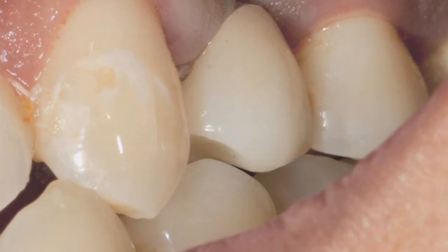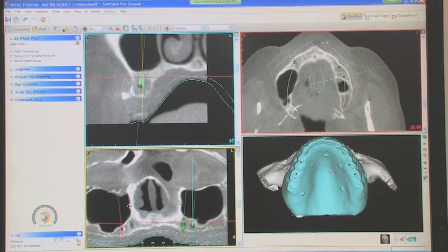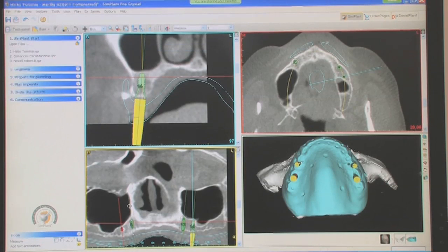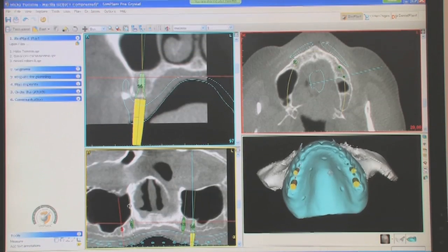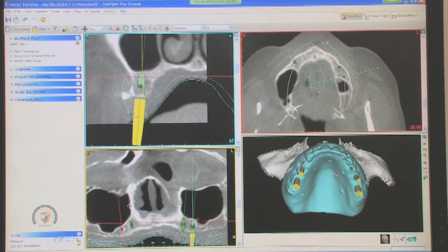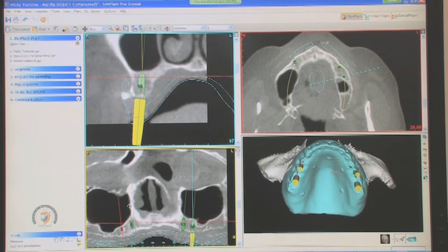What's nice about CT planning is that the implants and crowns are ideally situated so that forces are maintained along the long axis of the implant. If the implants can't be placed in an ideal position, then more conventional techniques of burying the implant, allowing it to heal or integrate so there's no forces put on it, is probably appropriate.